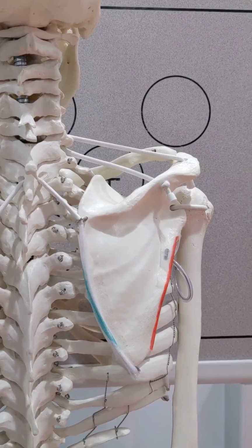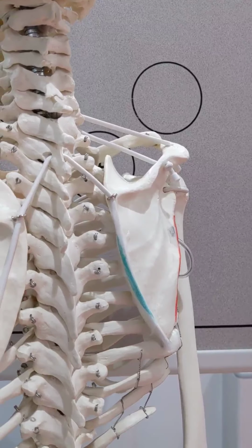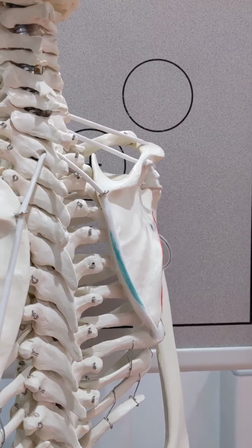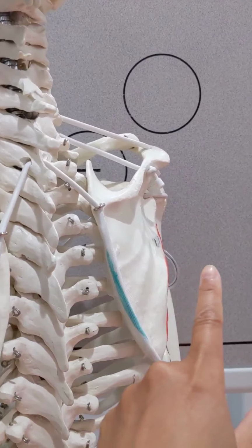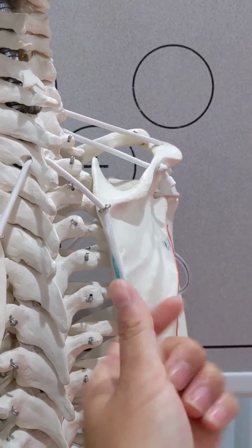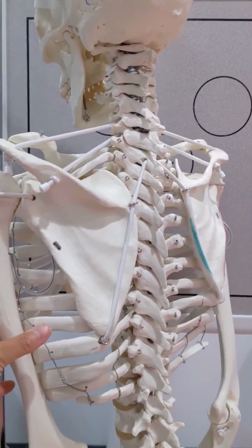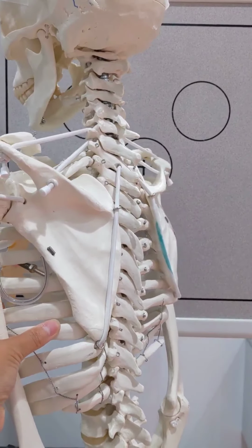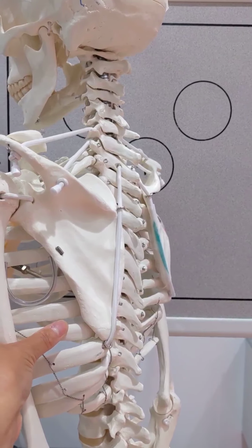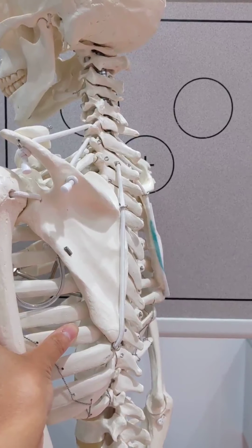So if you watch the green line and the red line, I'm going to turn the patient a little bit this way. And what you're seeing is that the two lines are getting a bit closer together, aren't they? So now they're only this far apart. And as I move him more, as I rotate the patient more, the lines are getting closer and closer together until what we actually see are the two lines superimposed.